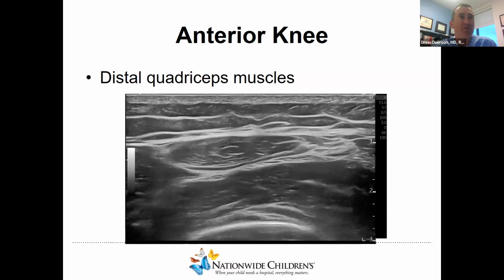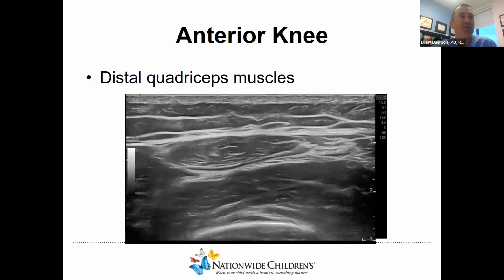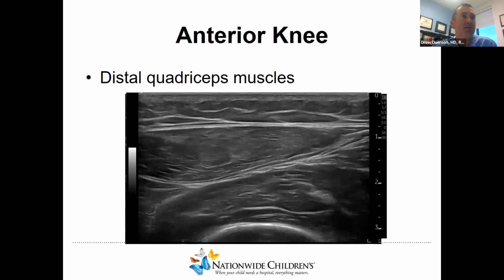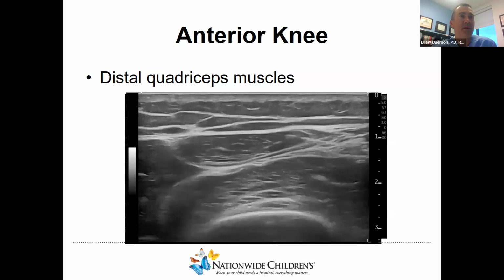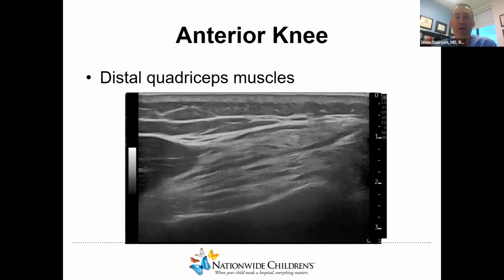So now that we've looked at the muscle in short axis with some still images, we'll do a short axis slide distally until we get closer to the distal femur and evaluate those muscles. So once we've done this kind of short axis survey, I do like to look at long axis, especially in this case, near that distal vastus medialis, as this would be a common location for pathology.